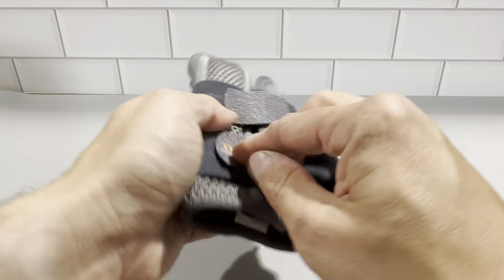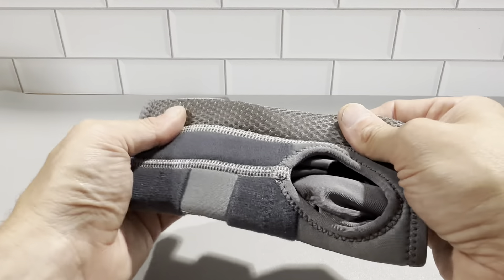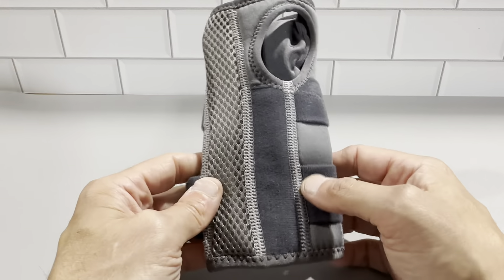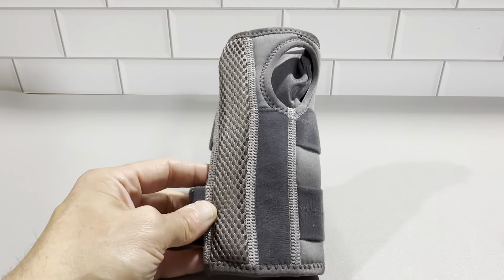The velcro is really good here. It's going to give you a nice feel once you have it on the wrist and it's definitely going to give you the support that you need. So definitely check this out — this is the Dr. Brace in gray color and this is a really nice brace.